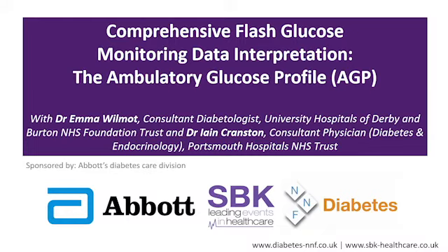Somebody who happens to have a hemoglobin A1C of 7% actually may have very problematic glucose control, and to try and reassure that person when they know that their experience is problematic is very difficult. But the reassurance based upon the time in range, assuming that they're achieving both time in and time below targets, can be a pretty absolute reassurance, in honesty. And I think that's a really powerful position to be able to come from.